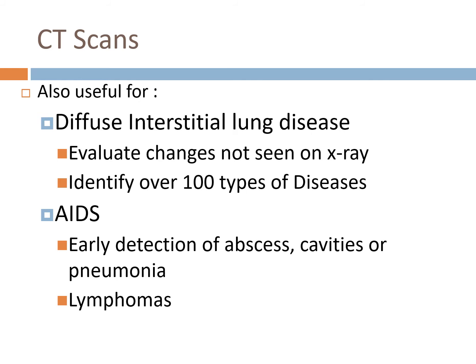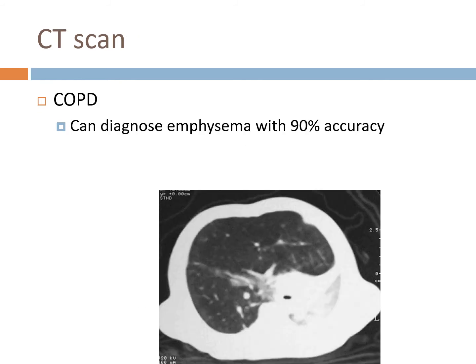So you'll definitely be going to CT. I have to say though, we do CT of the chest, but we do a lot of CT of the head to see if someone's had a bleed, or if they're a trauma. They always go to CT to look at their head and their spine and their chest. Again, a CT is much clearer and more detailed than a chest X-ray.